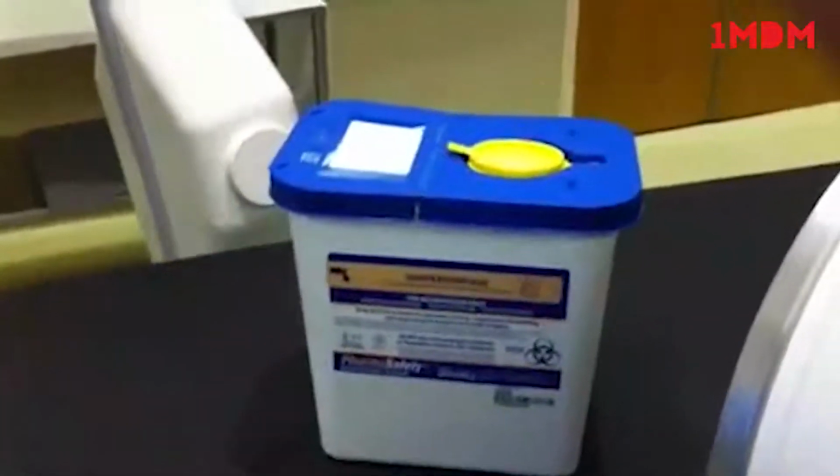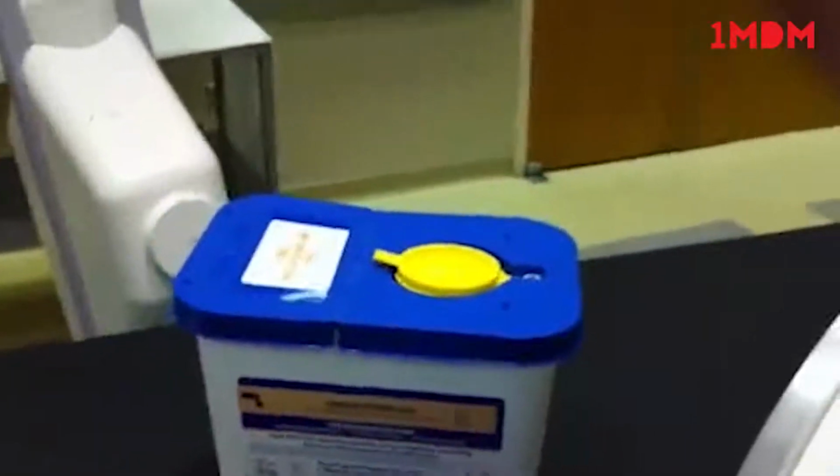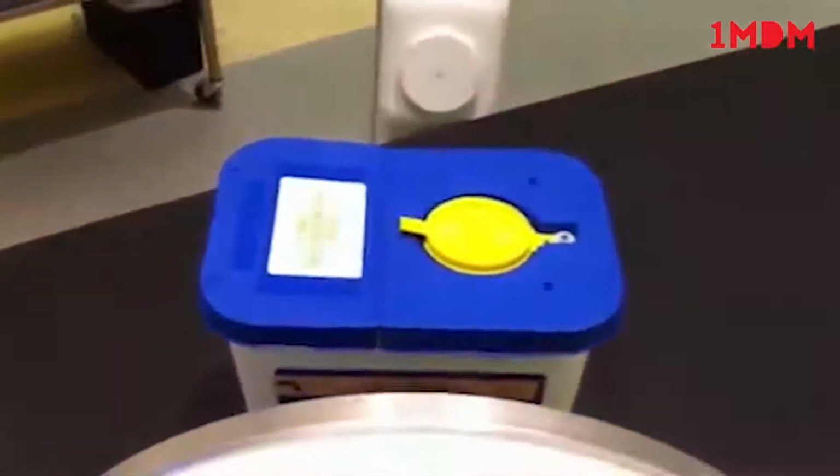And you can see that where it's being centered, which is right there, the centering point is not changing. I'm stuck here. It's kind of hard to move. This is really done with two hands. It's hard to do with one hand. You need two hands to do this. Now look at this. You almost got it perfectly centered, and I didn't have to move the machine, at least the base of the machine, to recenter.